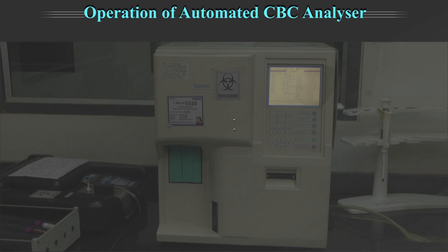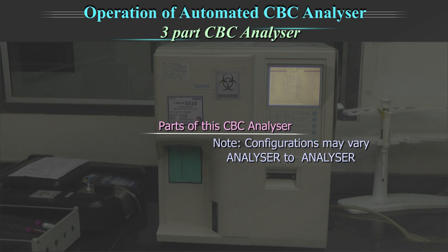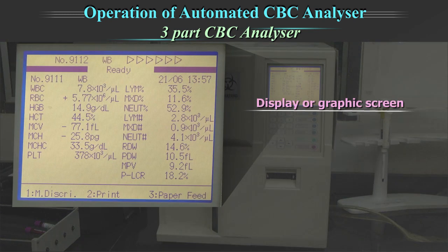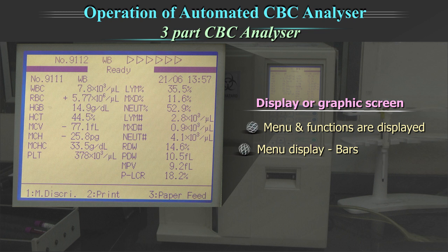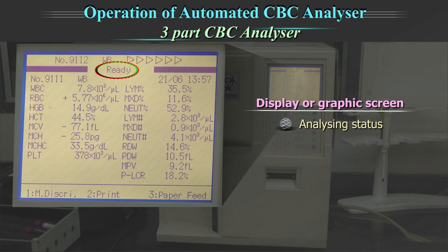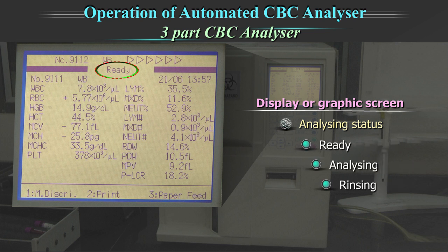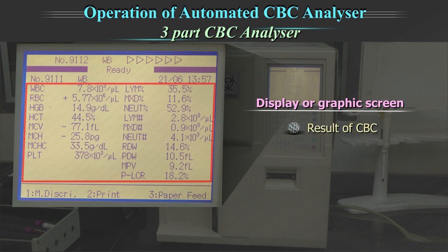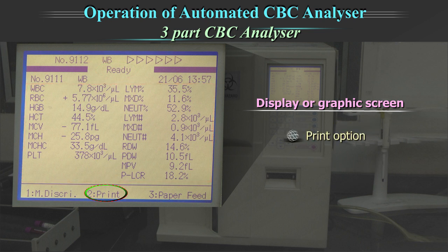We will now examine a three-part CBC analyser. Parts of the CBC analyser include the display or graphic screen where menu and functions are displayed. In the menu display, we can see bars for the sample ID number, the mode, and the analysing status, which shows the actual process status like ready, analysing, rinsing, etc. The result of the complete blood count, print option, description and paper feed are also shown on the screen.